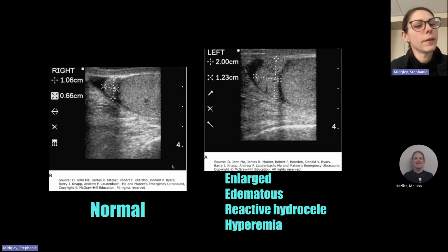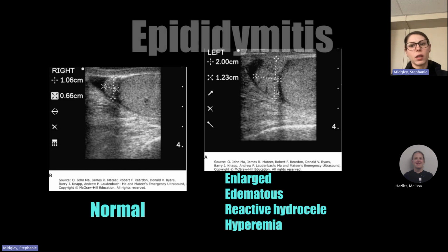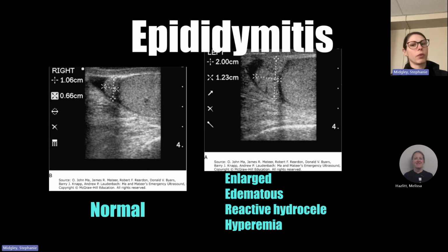Okay, cool. Moving on. The next one is going to be epididymitis. A normal epididymis is going to be small, and you're potentially going to have a little bit of fluid around it. When you have epididymitis, it's going to get enlarged. It's going to start to look edematous, just kind of big and bulky. You're going to see a bit more fluid, so reactive hydroceles around it. And then when you put color flow on it, you're going to get hyperemia.